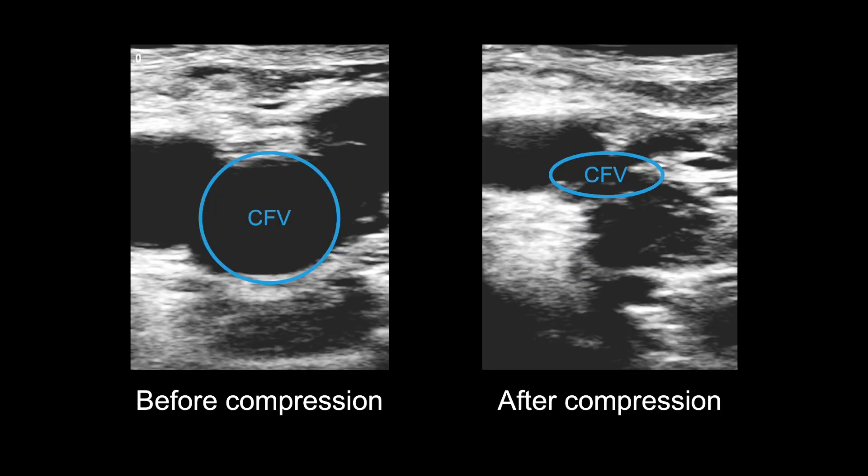This image shows the CFV before compression on the left and after compression on the right. You should compress the CFV in 2D transverse view to determine if its wall is fully co-apted. If the wall is fully co-apted, then there is no clot inside preventing compression. If there is not full co-aptation, there is something — namely thrombus — in the vein.